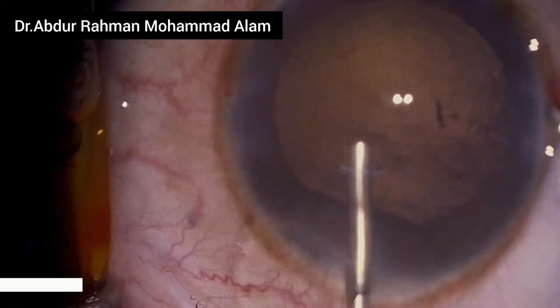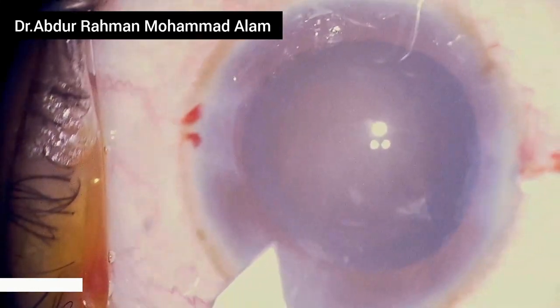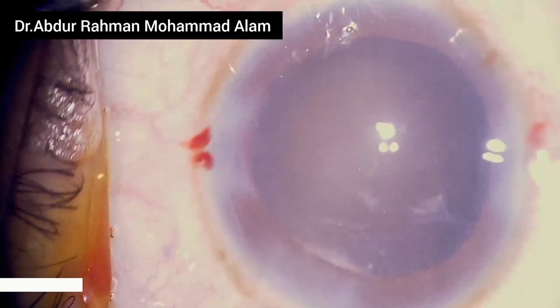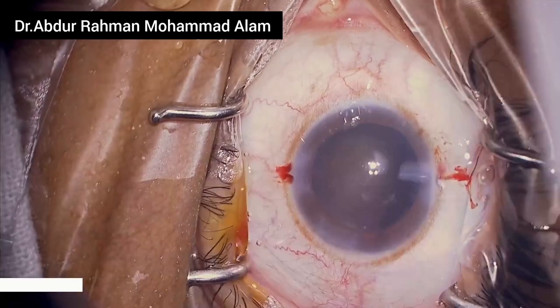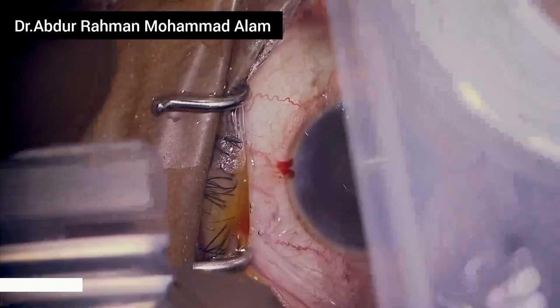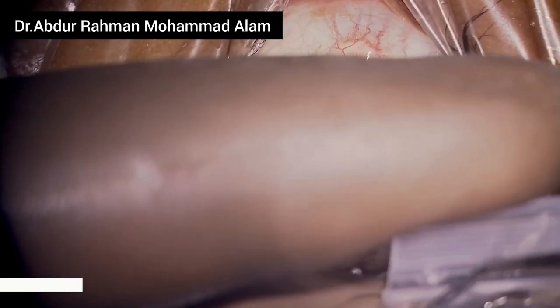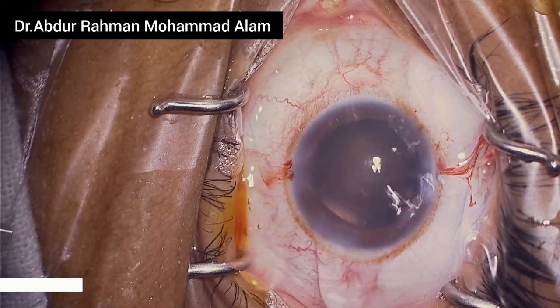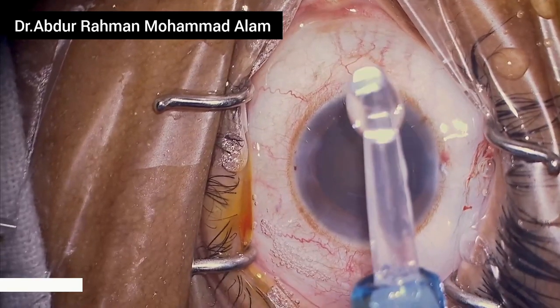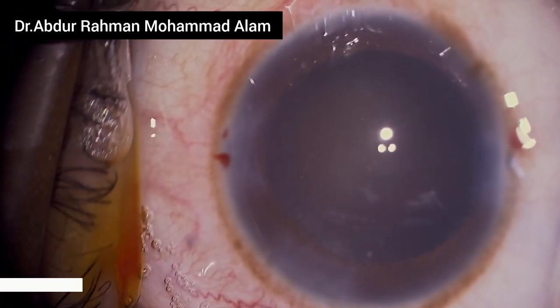After removal of the cortex, I'm injecting OVD. I increased the incision size from 2.4 to 2.8 millimeters, which will help in intraocular lens implantation with this cartridge. Now I'm loading the intraocular lens in the Monarch cartridge. Care should be taken while closing the cartridge that you do not catch hold of the haptics. See if the intraocular lens moves freely through the nozzle of the injector.